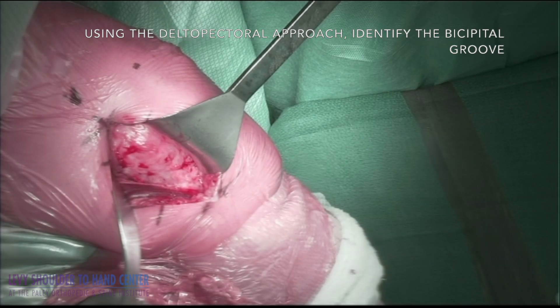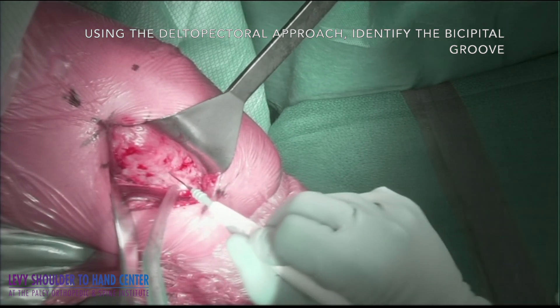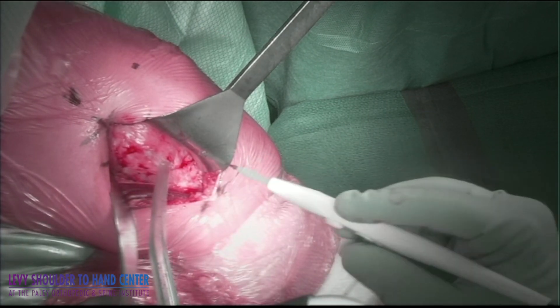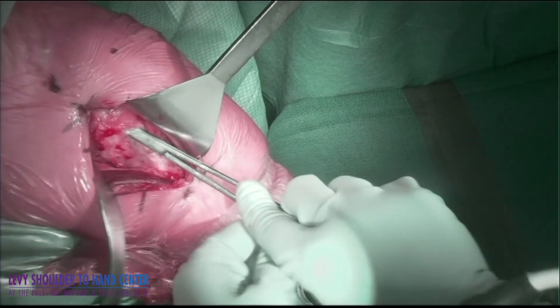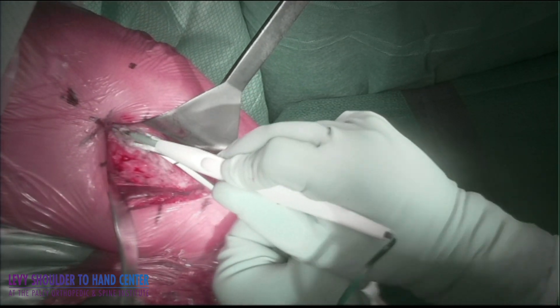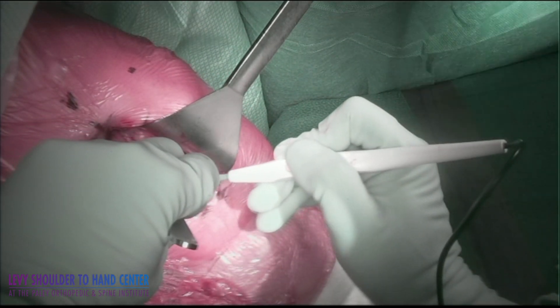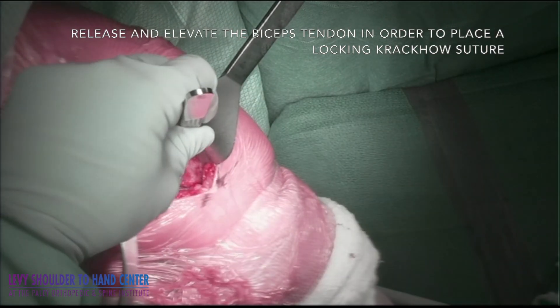Here you can see the deltopectoral interval; the bicipital groove is identified, and the transverse humeral ligament is released. I typically start more distally and use a schnitt tonsil to complete the release and opening of the rotator cuff interval.